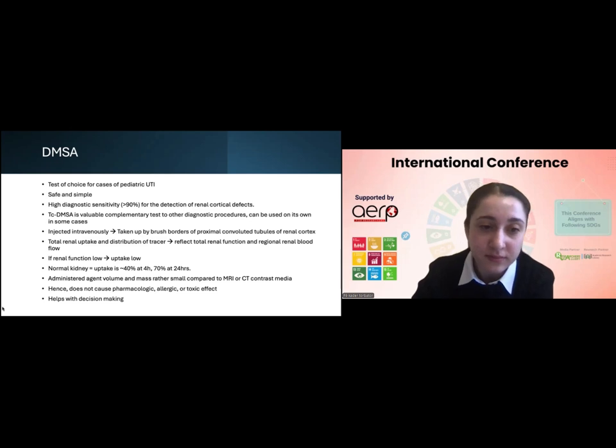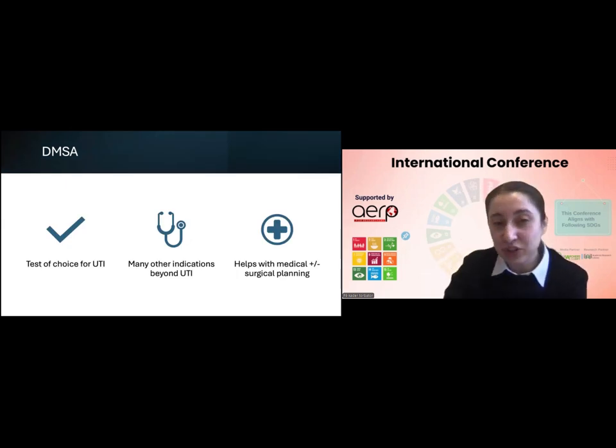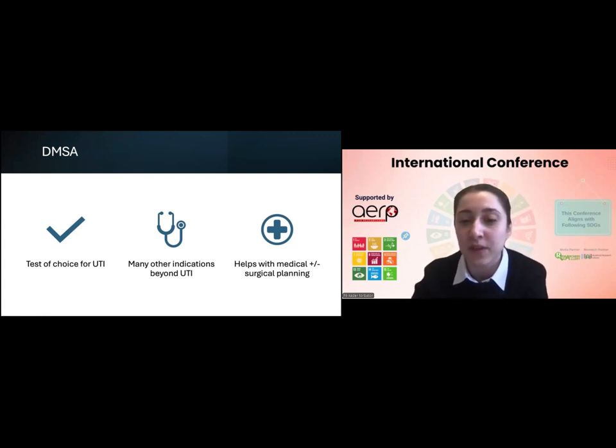cases. And it helps with decision making, as identifying any loss of function would help us with surgical and medical management of children. So, as I mentioned, it is a test of choice for urinary tract infections globally. However, it has many other indications that clinicians may not quite be aware of, especially in secondary centers. And it helps, as I mentioned, with decision making.